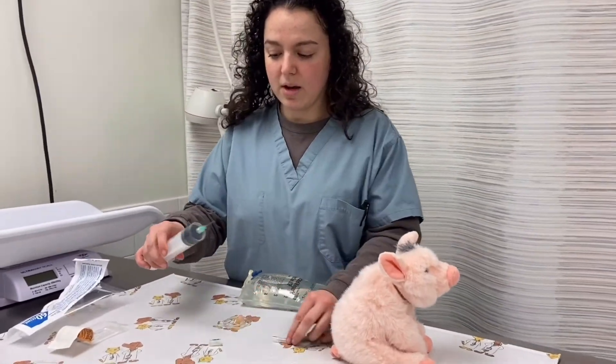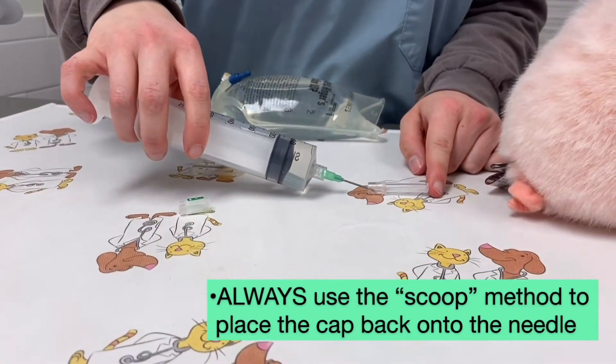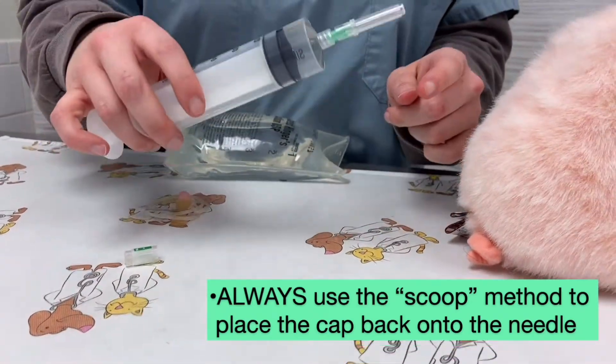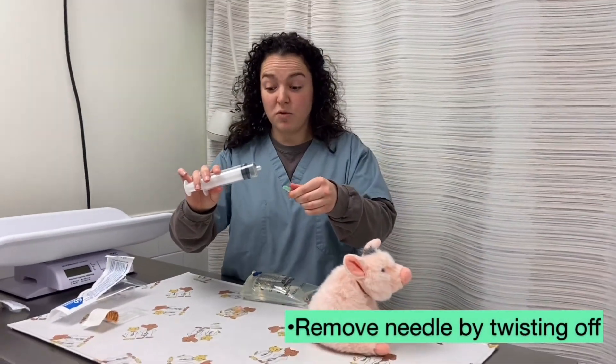To place the cap back on the needle, you'll want to use the scoop method, where you can gently place the needle into the covering and scoop it up, then secure it onto the needle. Twist it off to remove it from the syringe.